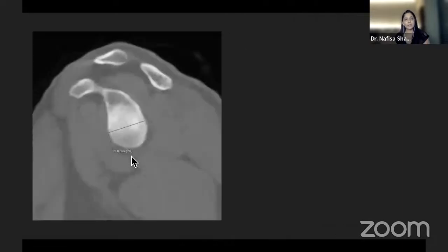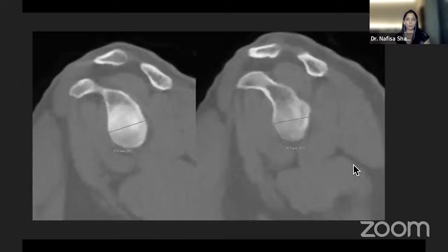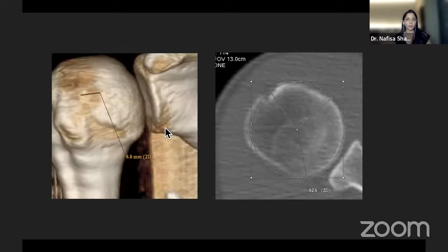Again, CT helps us immensely. We just take the diameters on both sides. And the glenoid difference in this case was 2.3 mm. Now we calculate something called a gamma angle, which is measured between the medial side of the reverse Hill-Sachs defect and the deepest point of the bicipital groove. Both of them cannot be on the same level, and at times you have to superimpose the images, so it may not be very accurate the way I'm showing you.